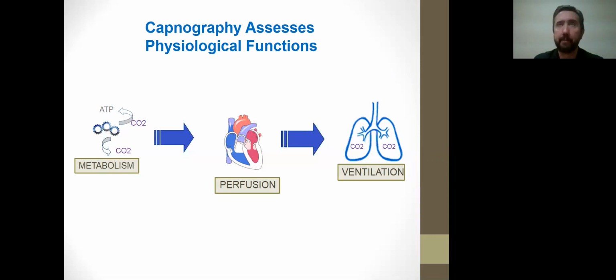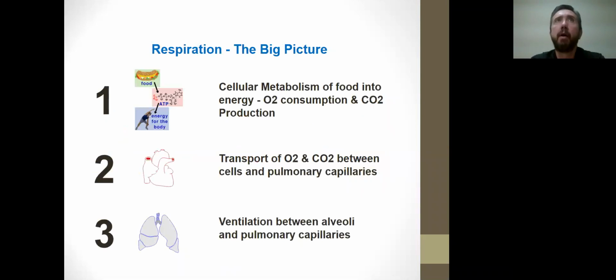Now, with respiration, tie those together. All three components of respiration, as I mentioned, metabolism, transport, and ventilation, are involved in the appearance of carbon dioxide in exhaled gas. So the summation of all of that is that capnography is going to give us an excellent picture of the respiratory process.